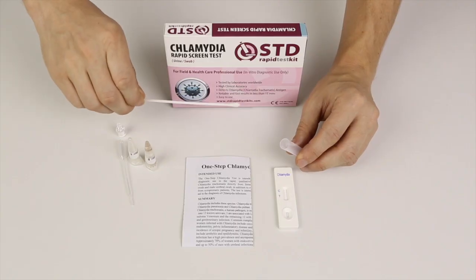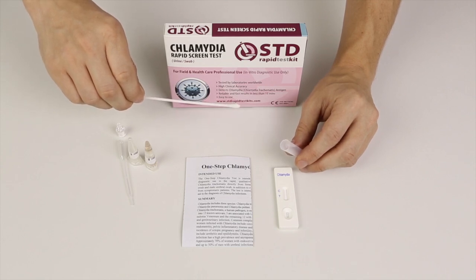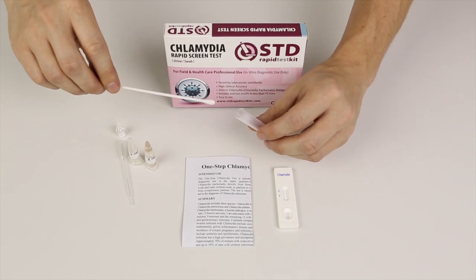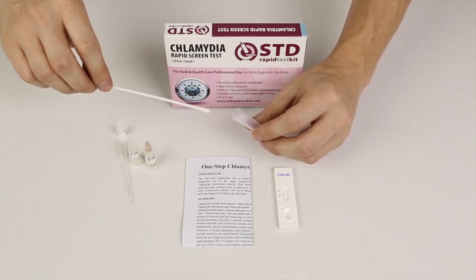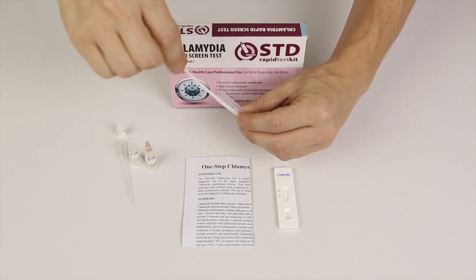I have collected my own specimen. It wouldn't be appropriate for you to see that, so I haven't shown it here on YouTube. But I've collected my own specimen and I'll now put that into the mixing tube with buffer A and mix it up like this.